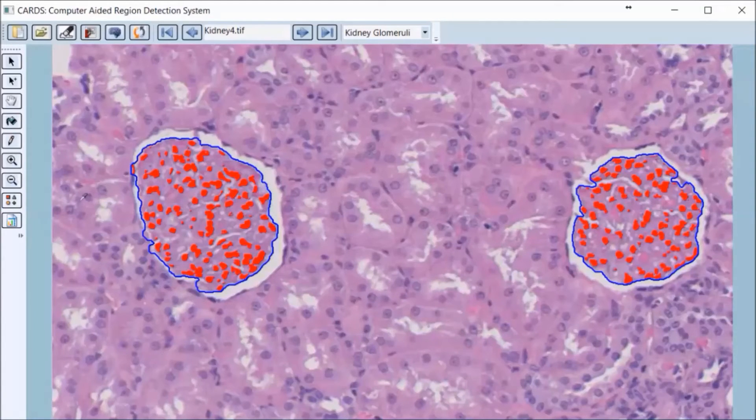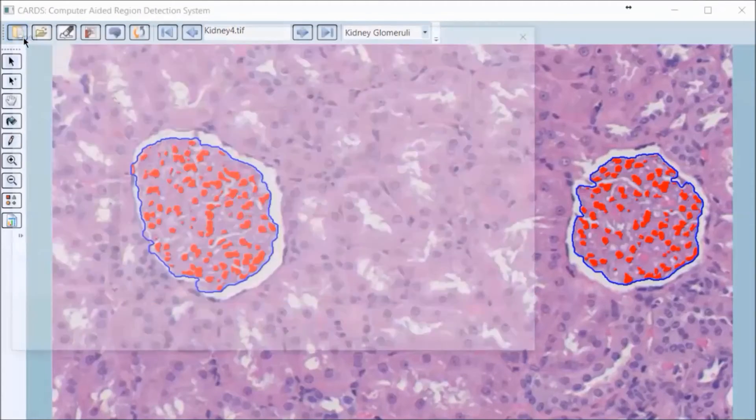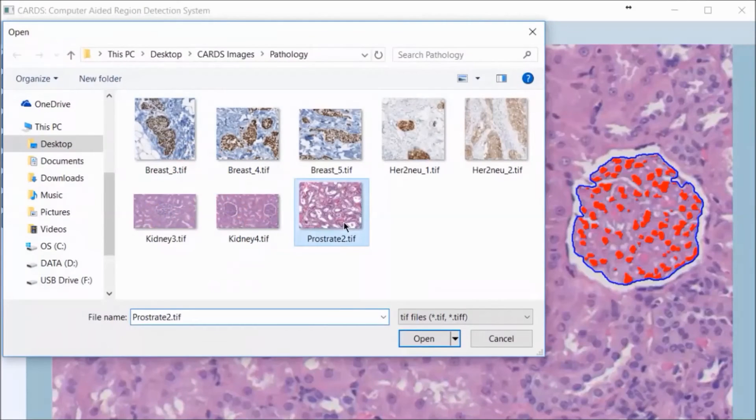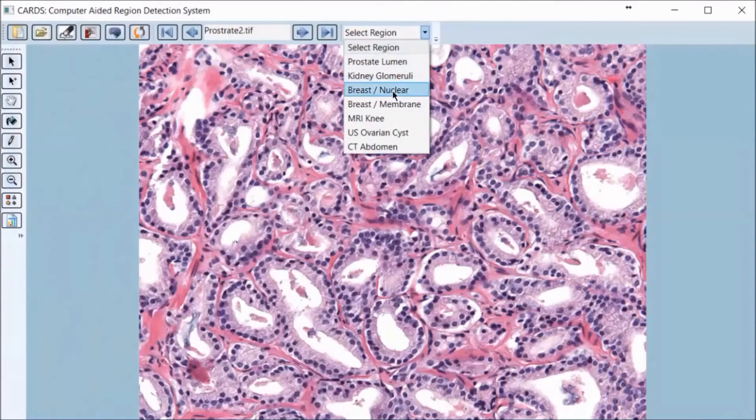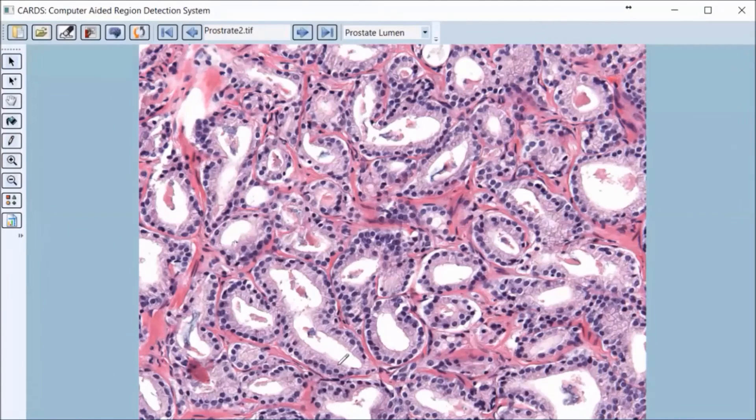The application can also be used in the education space, as evident with the prostate lumen image. Students of pathology can use CARDS as a tool to identify the regions they are looking for. In this case, the algorithm will teach them to identify the lumen.